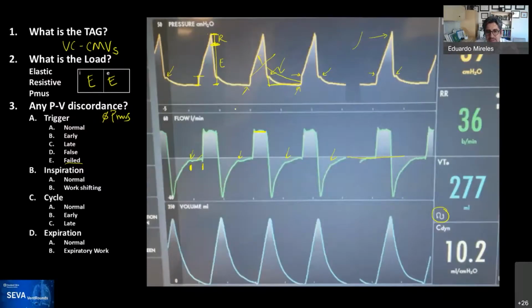And so I presume that that's what we're seeing here, that the machine saw the pressure drop very fast, and it said stop, or we're going to overshoot, and he's going to lose a lot of PEEP. So it may be the algorithm. Yeah. Cool. Does that make sense? Yeah, it does. Thank you. No problem. Any other questions from the team?